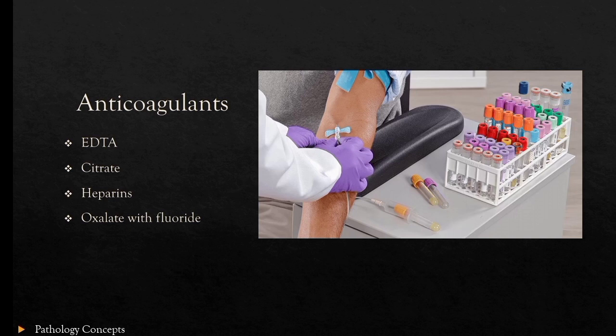What are anticoagulants? They are additives that inhibit the clotting of blood by different mechanisms. They are EDTA, citrate, heparin, and oxalate with fluoride.